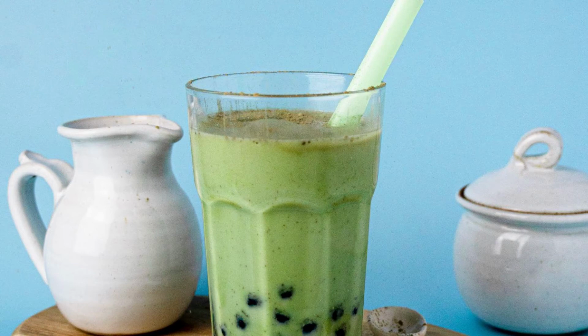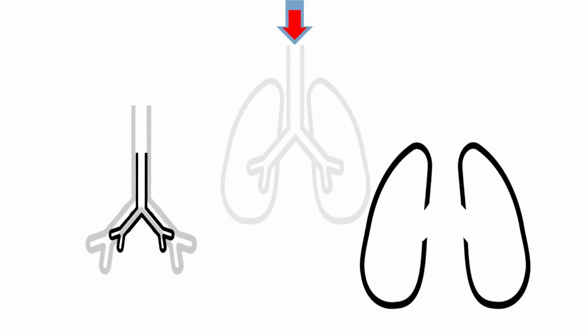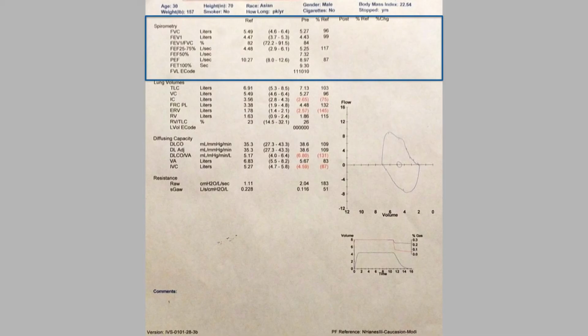Think about drinking a thick milkshake. Instead of a strong straw, which lets you drink anything you want, even bubbles, you have to drink that same thick milkshake through a flimsy, collapsible straw. It's not that easy, right? Now imagine that that's your breathing, every breath you take in your life. We measure these airflow problems in this section, again called spirometry.